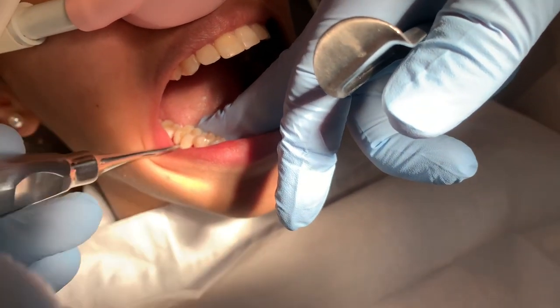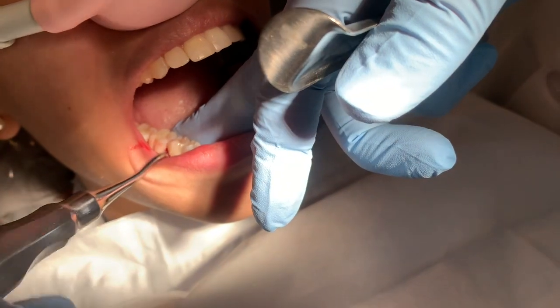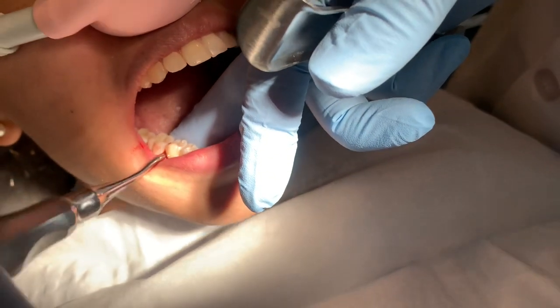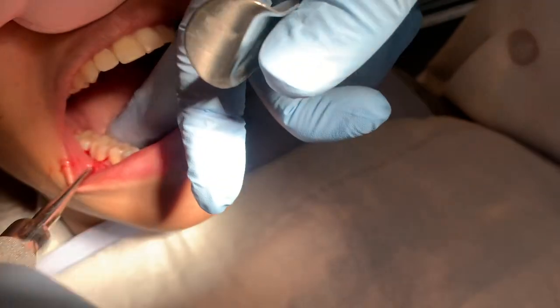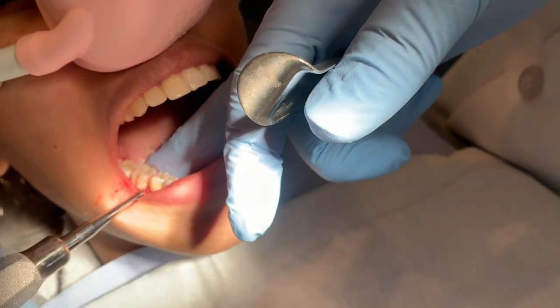Does that hurt at all? Mm-mm. You'll feel the pressure of me wiggling, right? But you don't feel any deep down pain. Okay. Does seem to be moving pretty well. You want to kind of go slowly and steadily. Ease it out.